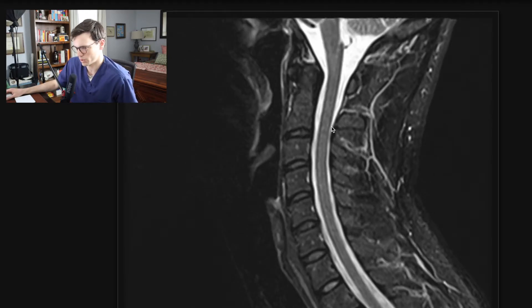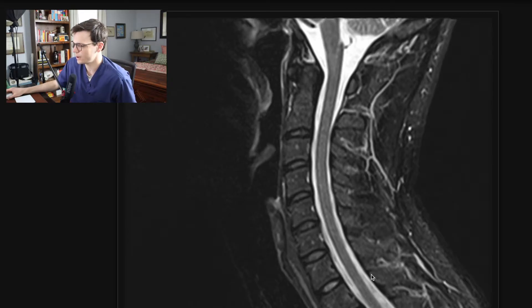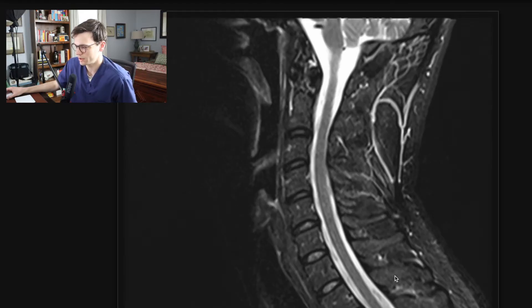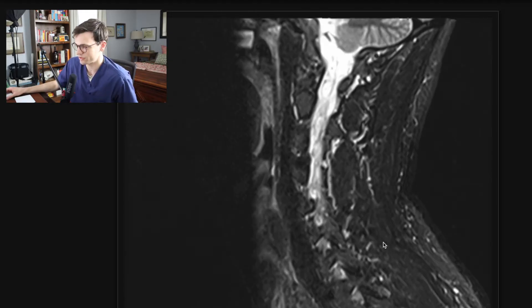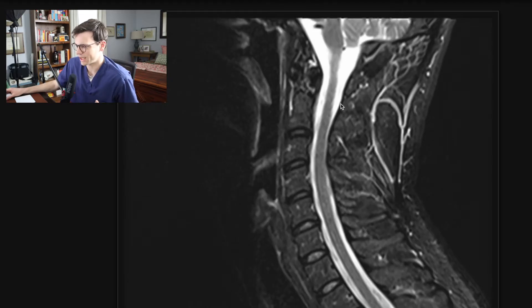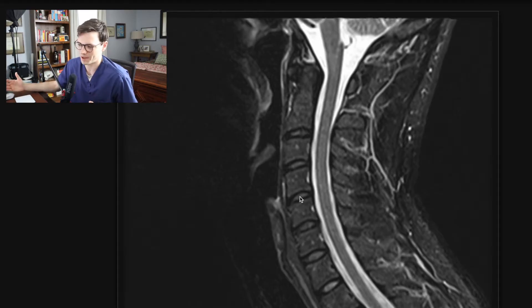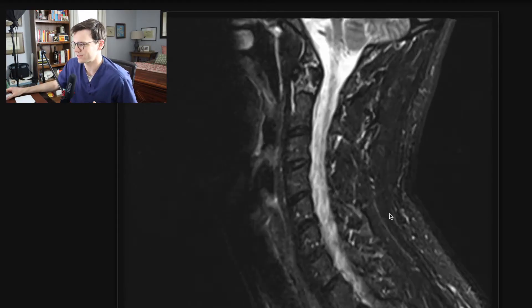STIR is an even more sensitive sequence than your T2s at looking at the cord. I always look at the cord beginning at the brainstem all the way down to the upper thoracic cord, both on the T2s and on the STIRs, just to be as thorough as possible. The good differential to always think about is radiation-related change, trauma, demyelination, infection, or neoplasm. This is a good example of a normal STIR sequence — by spending time on normal cases, you'll get an idea of what brightness is pathologic versus normal.